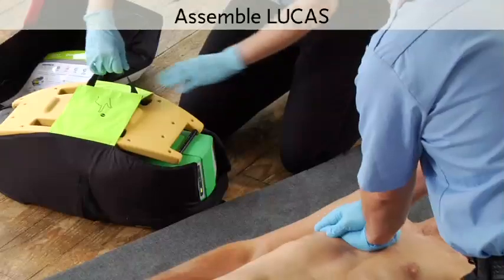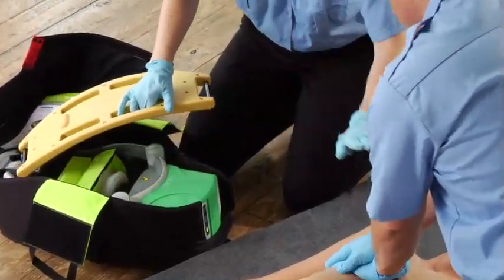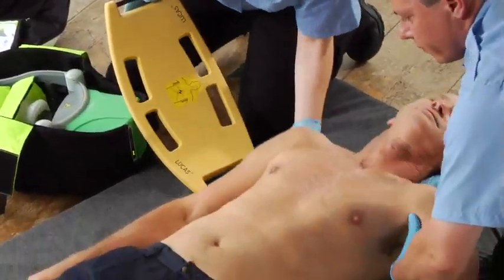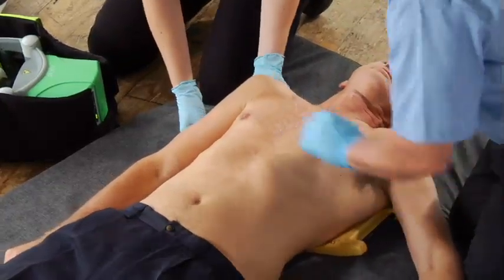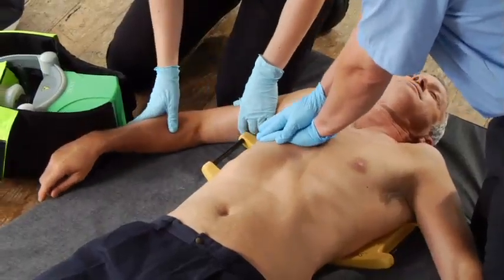Assemble it on the patient. Get out the back plate. Stop compressions briefly and slide it under the patient's back. If there are only two of you, one should support the head while both of you lift the upper body. Lay the back plate below the armpits. Clear the patient's arms away from the back plate at the latch points. Keep doing manual chest compressions as much as possible to maintain coronary perfusion pressure. Clean off any gel or anything slippery from the patient's chest to help Lucas stay in position.